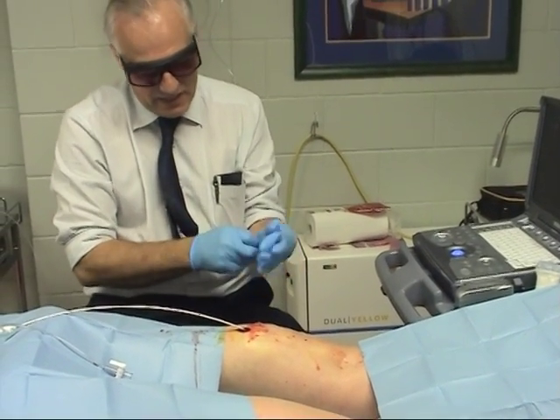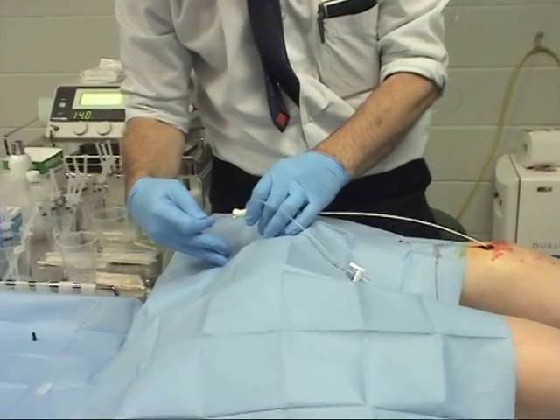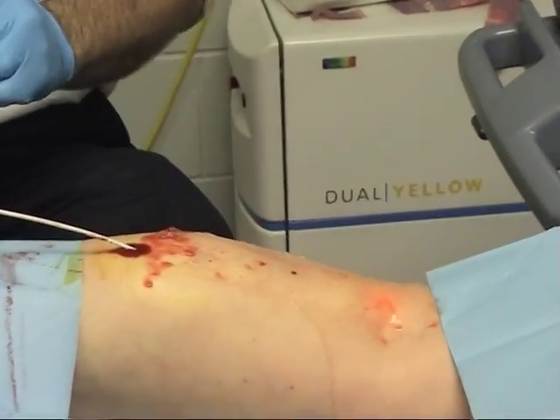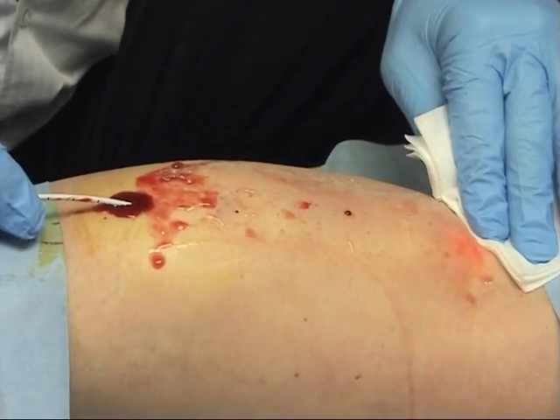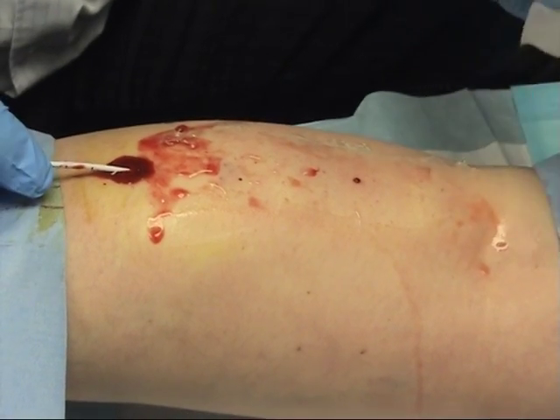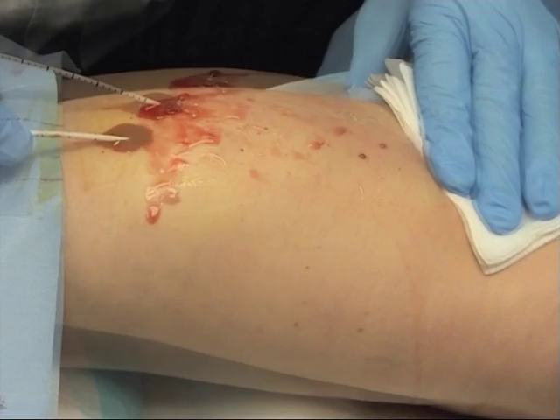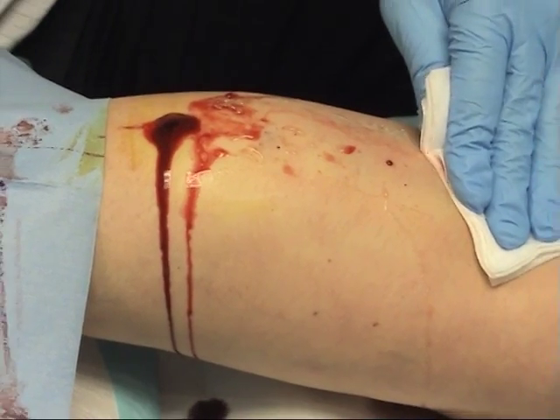It's not a problem, it's just as the blood heats up you get some of that sensation. So I'm just going to pull this back so the fiber is exposed. There's a little bit of a red light in the back of your leg where the laser shows through. I'm just going to pull it back slowly and just give it a little fire — you shouldn't feel anything. Nothing to feel? No. Just going to slowly pull it back as it fires.